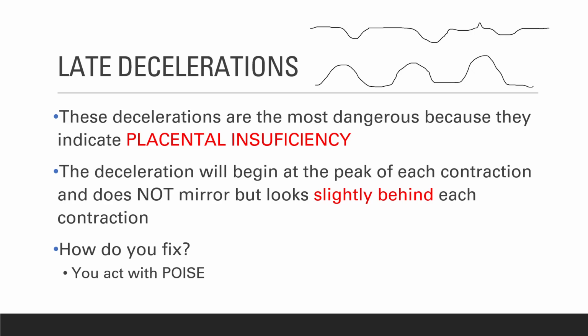So we will teach you a little bit how to care for patients when you see this type of tracing. We use the POISE acronym, POISE. In a little bit, we'll talk about how to take care of these types of patients if you see these types of strips.